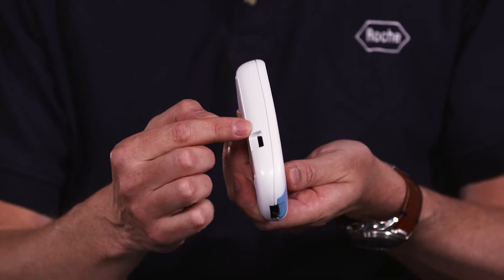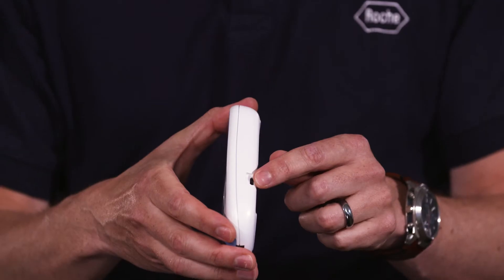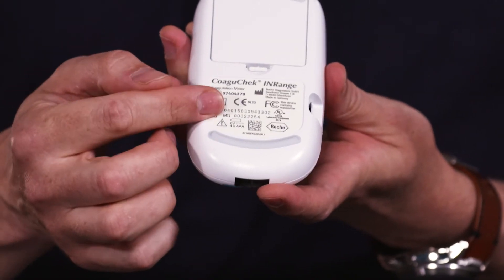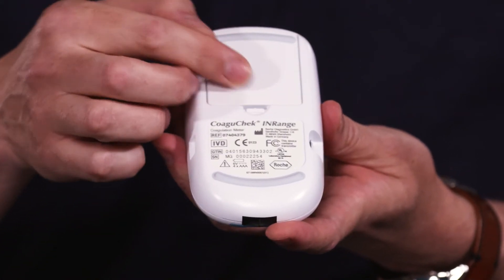On one side of the meter you have your co-chip port. Whenever you open a new pot of strips you will receive a co-chip and you need to insert a co-chip into that port. On the other side of the meter you have your USB port to connect your device to your PC. On the back of the meter you have your meter serial number and your battery compartment.